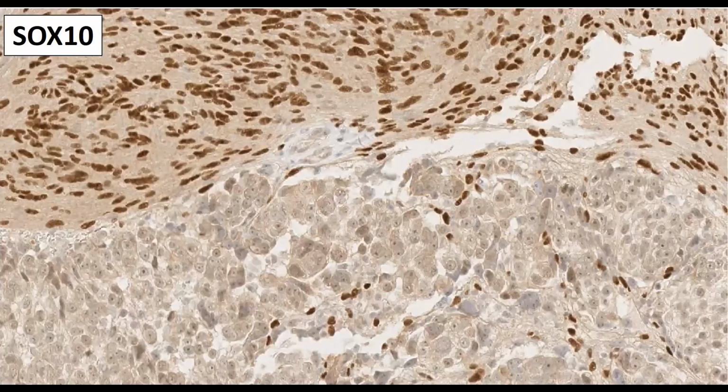All right, here's the SOX10 at high power. You can see the top half of the screen. Look at all the positive nuclei in the schwannoma. Look at the bottom. These are all nuclei and they are negative. A little faint staining in the nucleolide side of it, negative. Not staining for SOX10. What does that mean? Probably not related to the schwannoma.